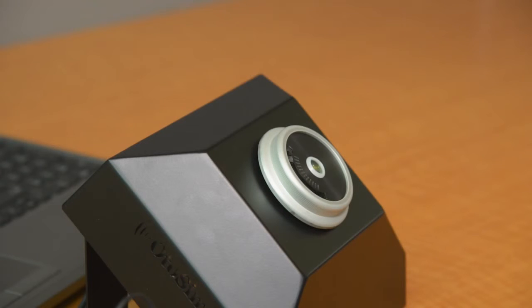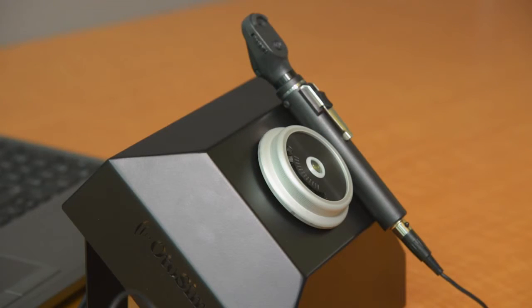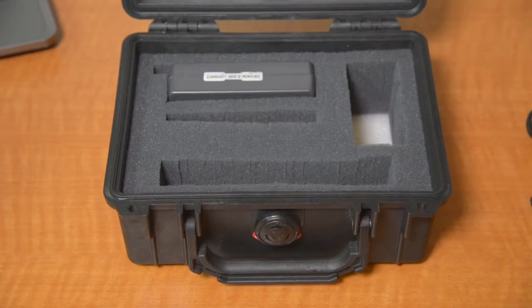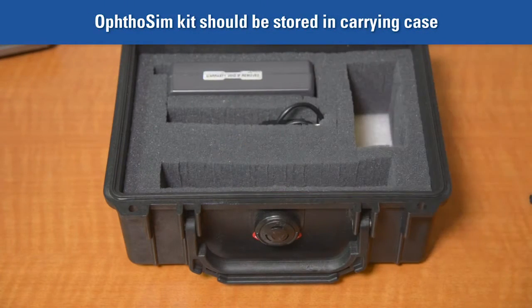When not in use, place the ophthalmoscope to the side of the eyepiece on the base unit. The magnet in the handle of the ophthalmoscope will hold it in place. When storing, the components of the ophthalmoscope should be put in the case provided, as the sensor box and ophthalmoscope are both very fragile.